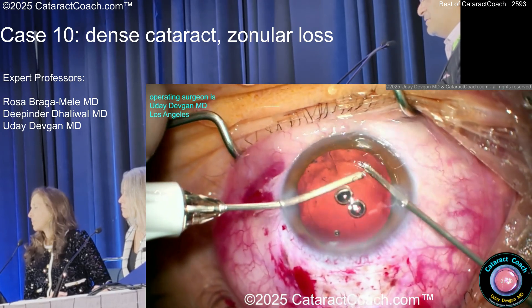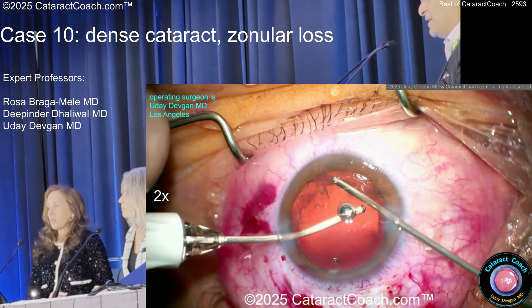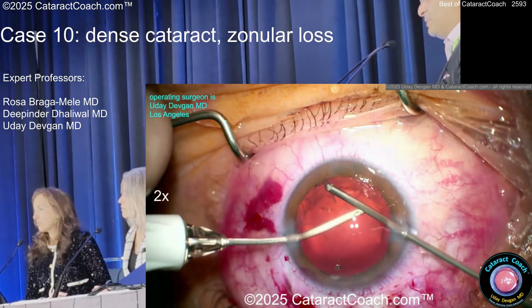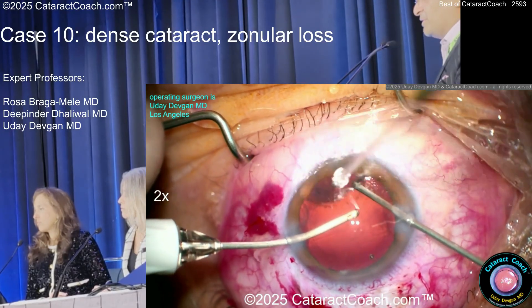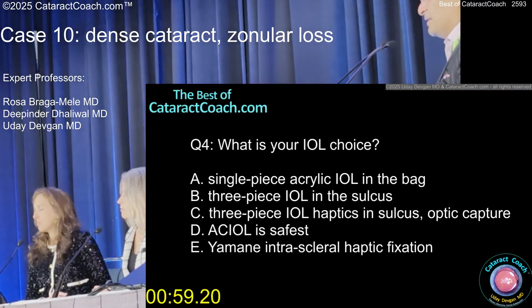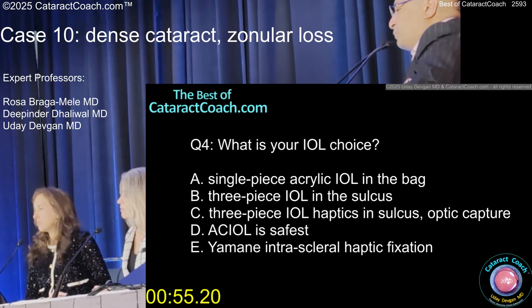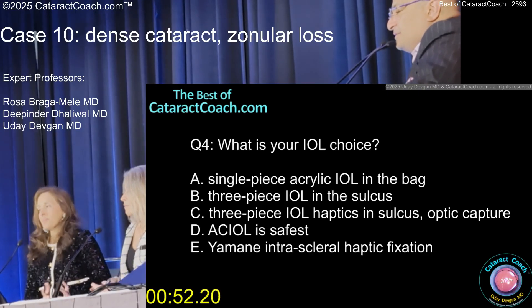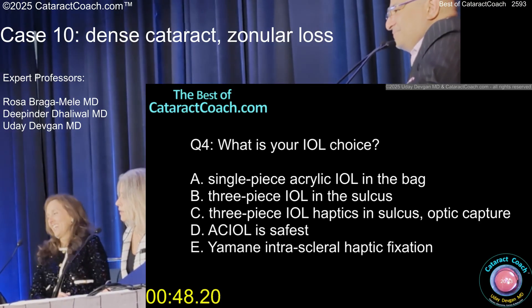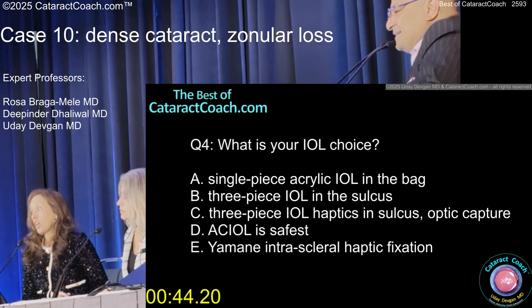Any pearls for not snagging the bag with the vitrector? Just be careful and go slow — high cut rate but slow hand movements. This is shown at 2x speed. Now let's talk about the lens: could you just put a single-piece in the bag? It looks stable enough. Or do you want a three-piece with optic capture, three-piece sulcus, or an AC lens?